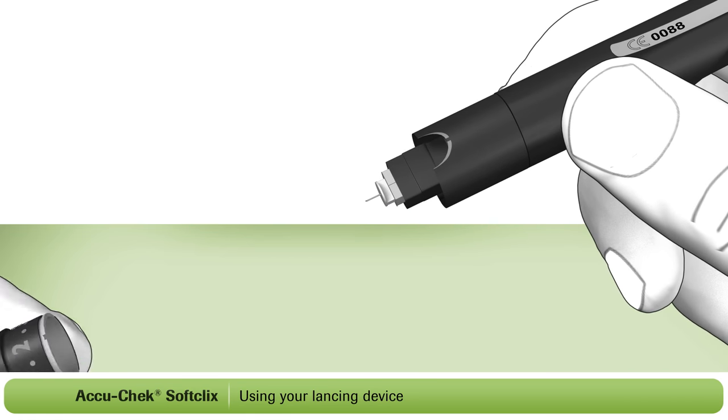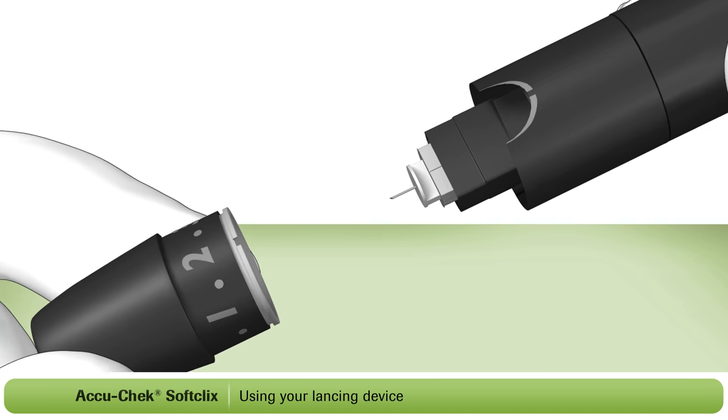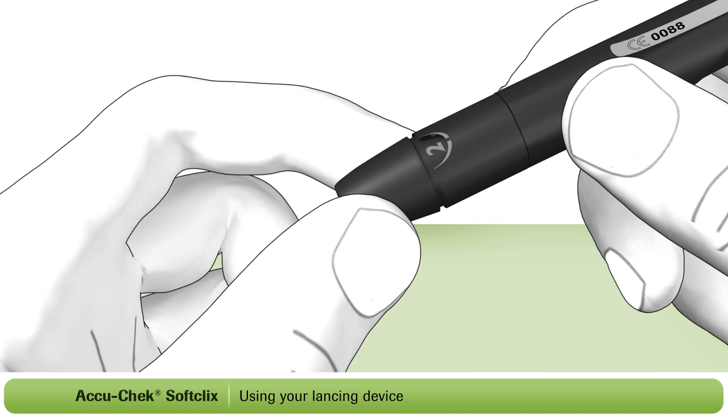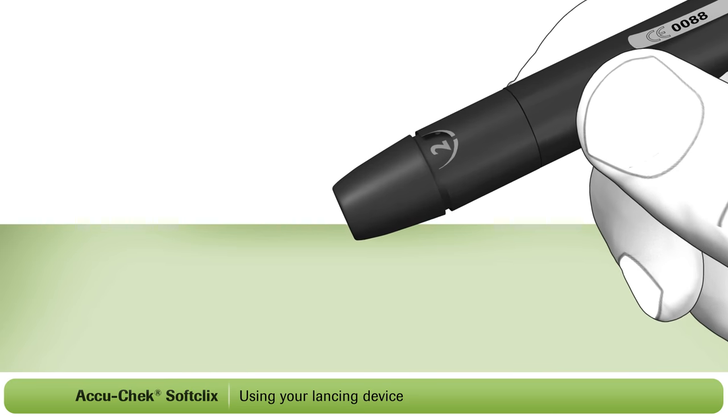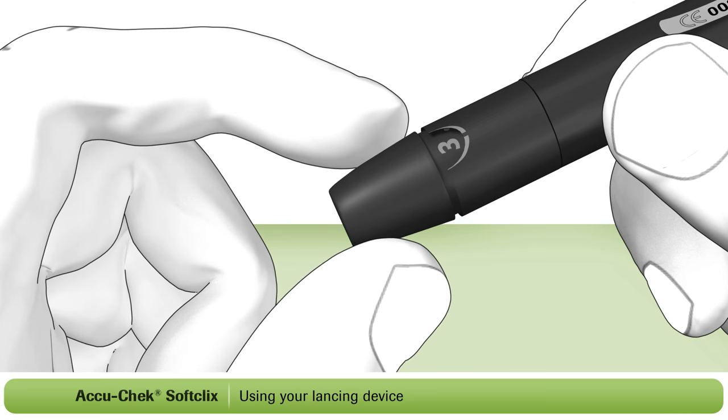Place the cap back on your lancing device. Be sure to align the notch of the cap with the markers shown. The next step is to set the penetration depth to match your individual skin type. By turning the dial on the cap, you can select the depth of the lancet.